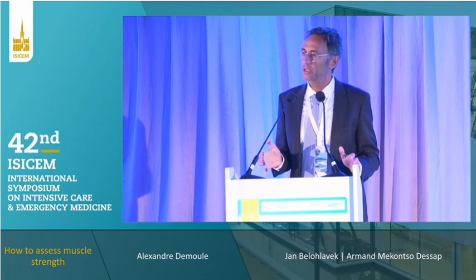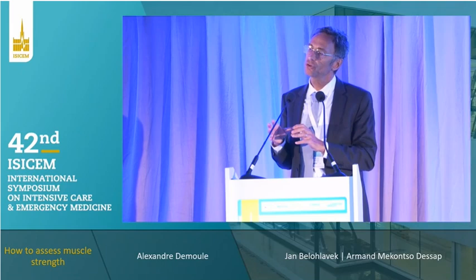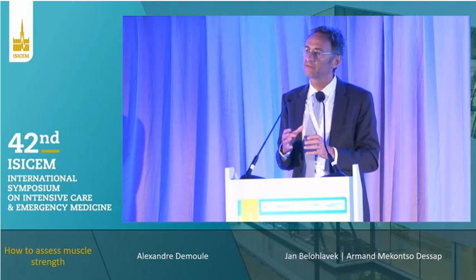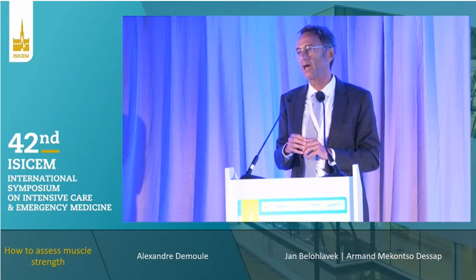Excursion, I did not mention the excursion, first because of the time, yes. And also because the correlation between excursion and diaphragm strength is not as good as diaphragm thickening fraction. It's not bad, but not as good. But to be honest, we do both. We do excursion and thickening fraction. For this talk, I prefer just to talk about the most reliable value.